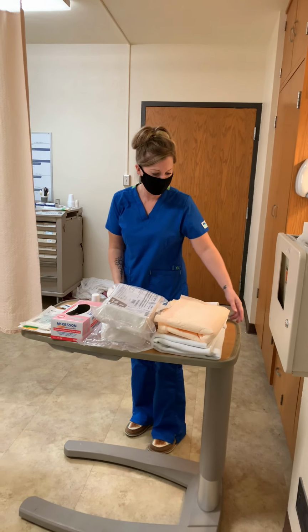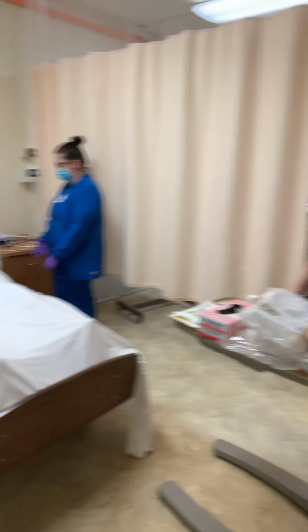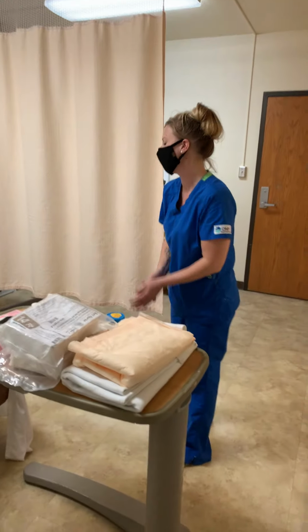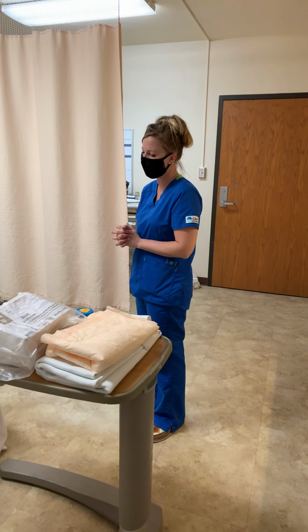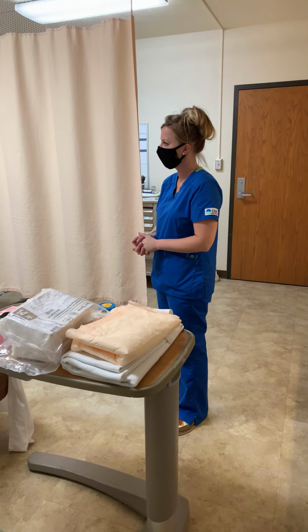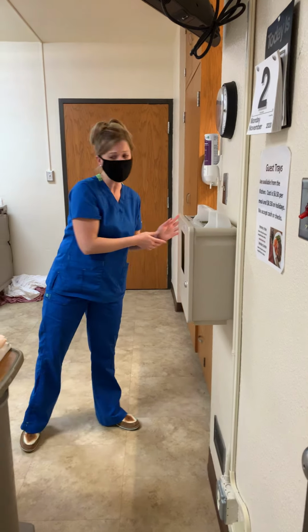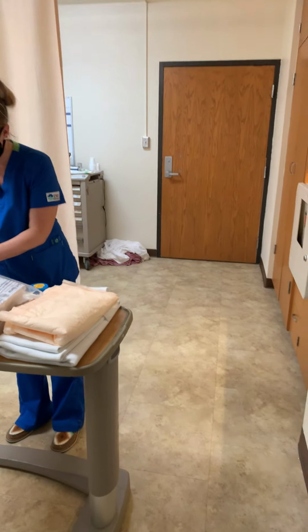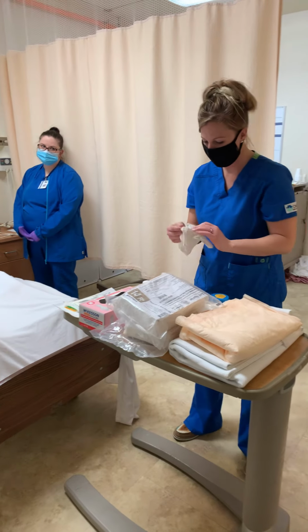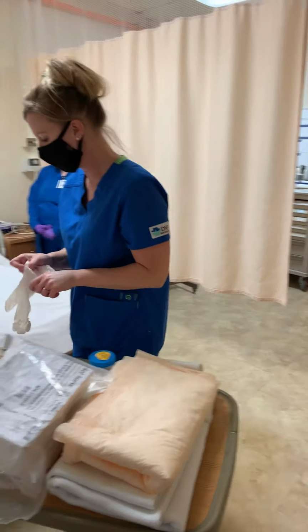Knock, knock, knock. Hi, Joanne. How are you today? Hi, I'm good. How are you? Good. My name's Sheena, and I'm your student nurse today. Dr. Jeff has ordered a catheter insertion. Were you aware? Oh, yes, ma'am. Okay. I would do hand hygiene, put on gloves. Joanne, can you verify your name and date of birth for me, please? Yes, ma'am. Joanne Jones, 12/3/67.